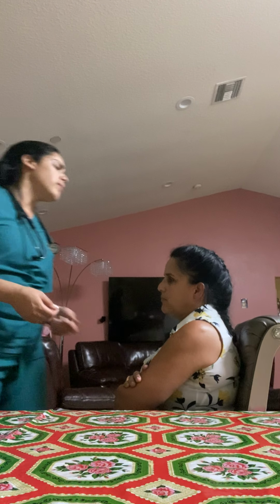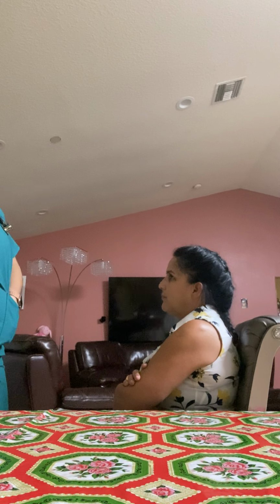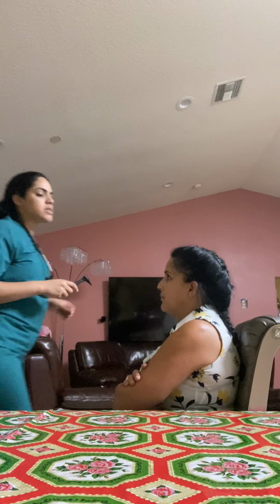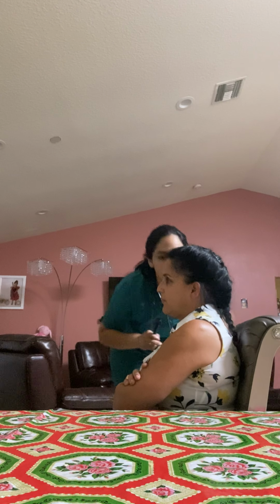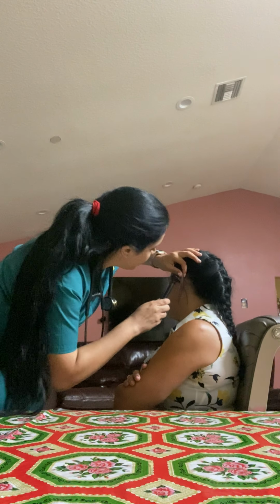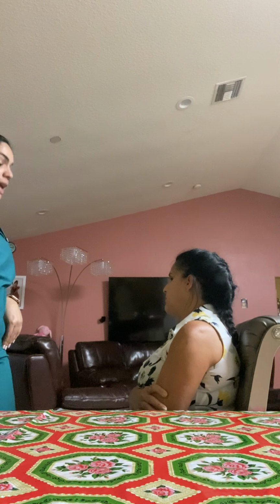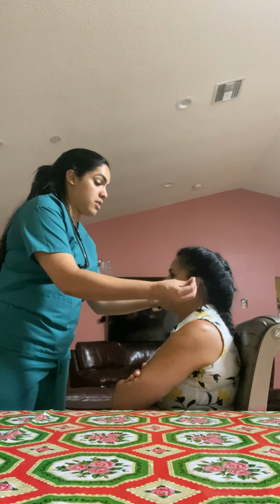Very good. I'm going to perform, before I look at your, you know what, let me look inside your ear first and see if I see anything inside there, okay? And I'm going to do this moving the pinna up and back. Very good. Any pain? Okay, good. No pain, no discomfort. Okay, let me see. Awesome, nothing there. Amazing.